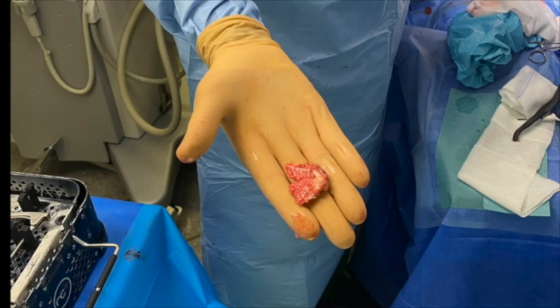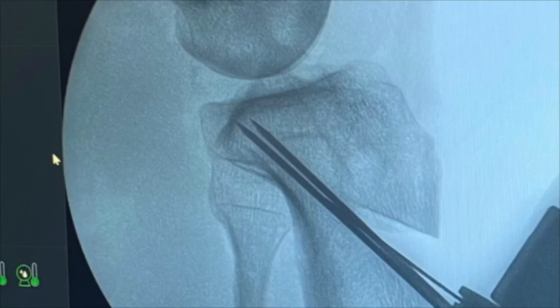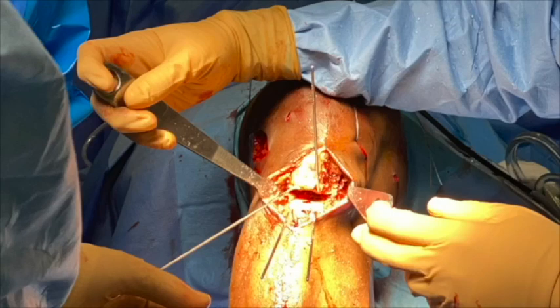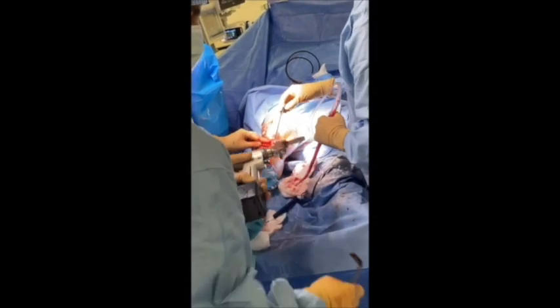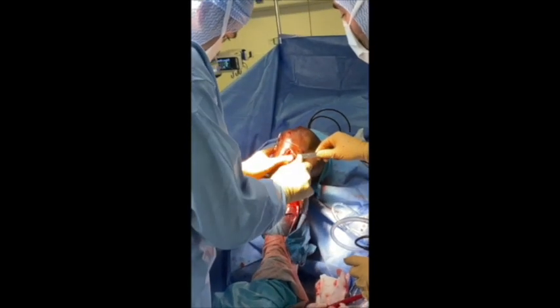We resect this fragment. It can be measured to confirm that its length is around 11 to 12 millimeters. We have this aspect then. The osteotomy is then closed by cutting the remaining part of the triangle on the lateral and medial side.